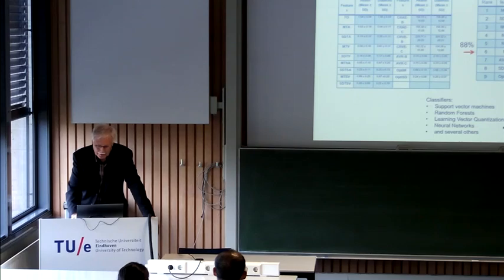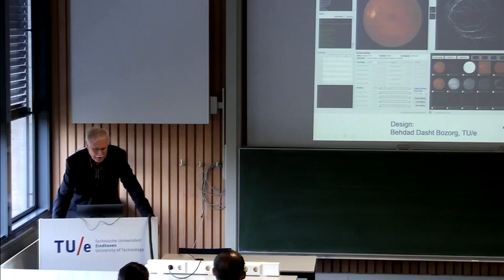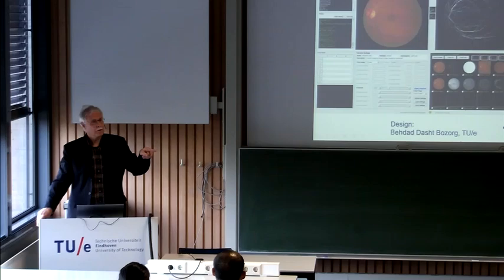So we were 88% right in. And of course, now we go to big data. We built a very nice workstation. Bedat, my postdoc, he wrote this. You have a patient selection item. You can make a whole pipeline of processing structures. And then this is for the research. You can see what are the intermediate steps. And to the right is a fully automatic report generator that reports what do we see quantitatively in your retina.